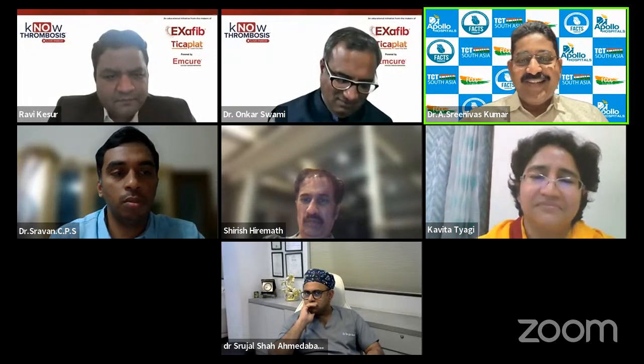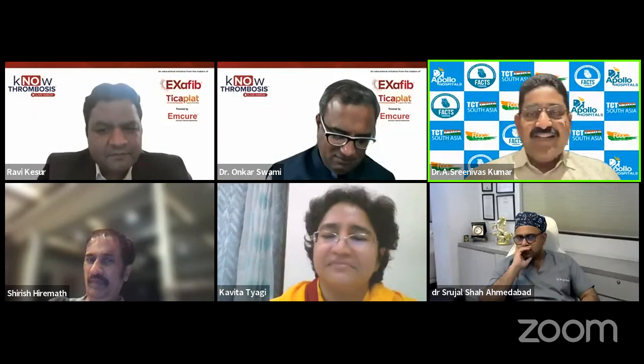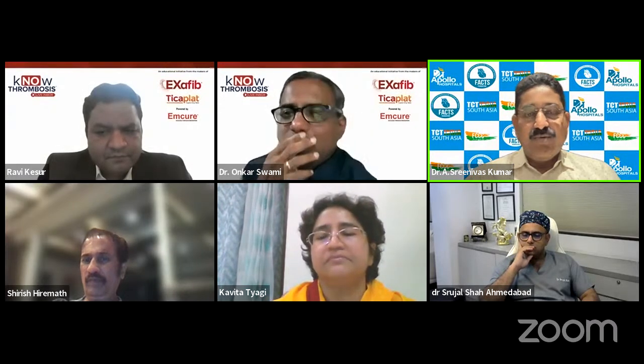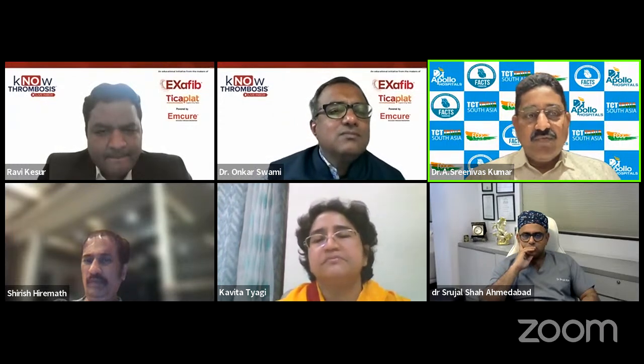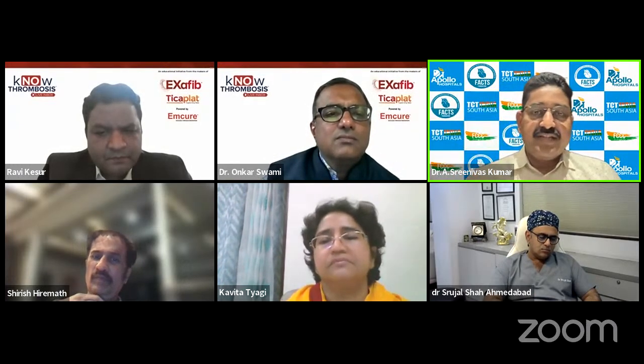No, anyway, no problem, because learning happens more in complications, and we can always learn from others' complications rather than producing complications ourselves. So what you have shown is a good calcified lesion, how it has to be assessed by OCT. And you've shown those criteria and how usage of IVL balloon helps to crack the calcium. The latest Ultreon version of OCT, what you showed in the slides, comparison pre and post, is supposed to give it also for more user friendliness. And it helps us to decide how to do it.